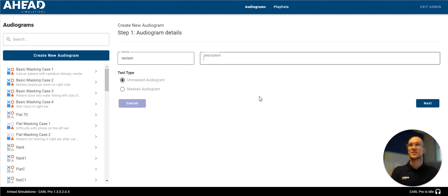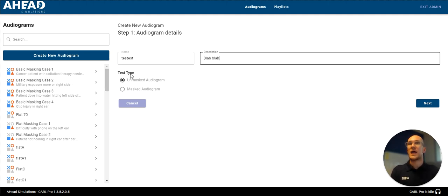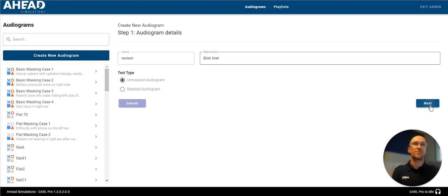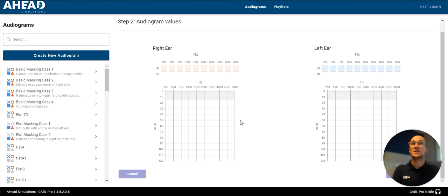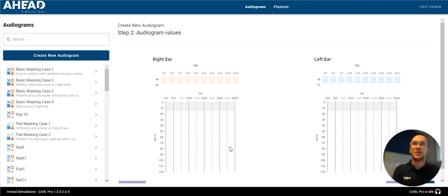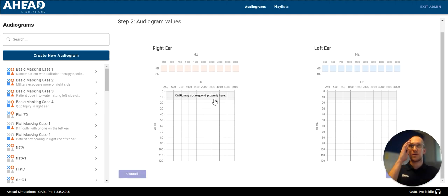We're going to create a test case. And we're going to stick with an unmasked audiogram. We're going to be nice and simple. When I click next, you'll see here's the plot that we can put in all our values for creating our own audiogram.